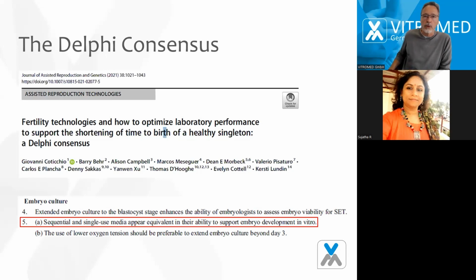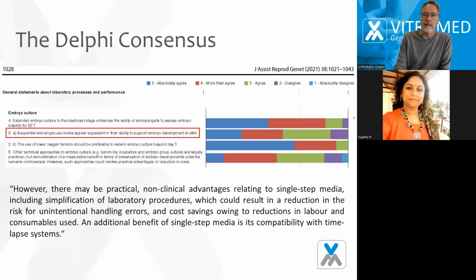And one result of this survey was that most of them said, sequential and single-use media appear equivalent in their ability to support embryo development in vitro, so that there isn't any difference in the performance. You can see this here. This is the sentence I just have read.